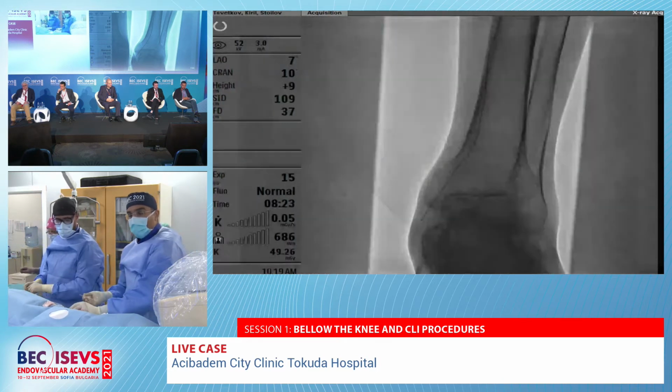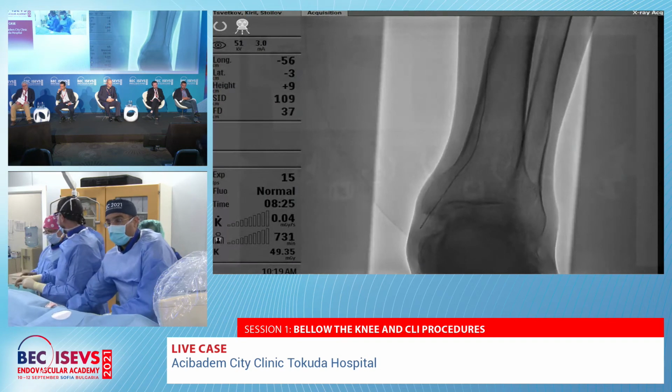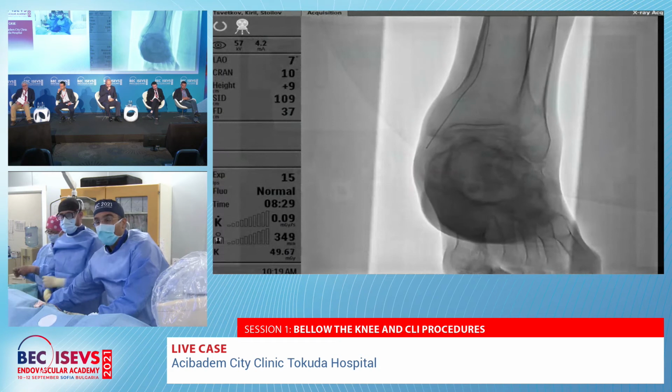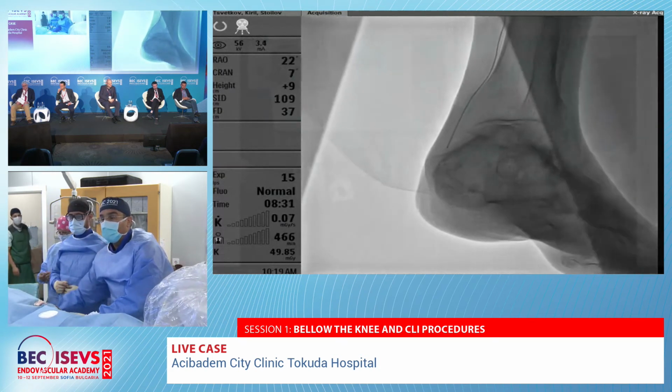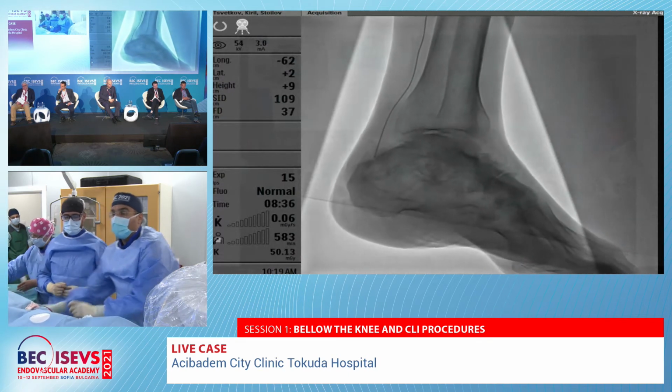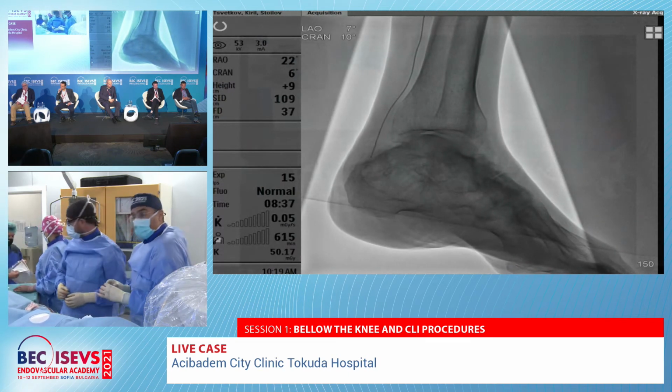And now I will change for an 014. Let's see, however, if we are in the right position. Command 14. Important is always to see it in different views. Okay. Do you want to make an angio? Yes, please, an angio. Okay.